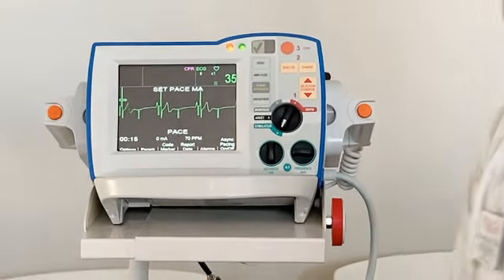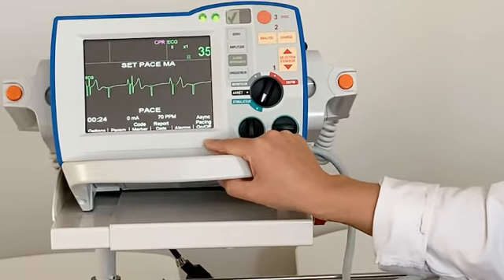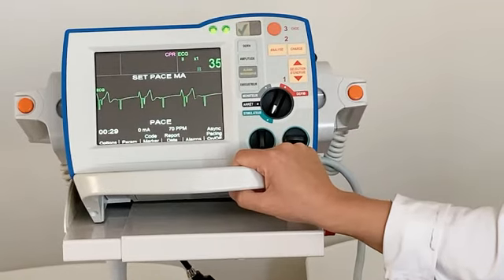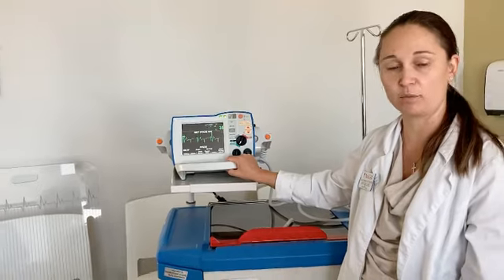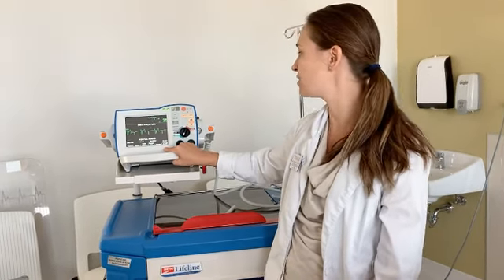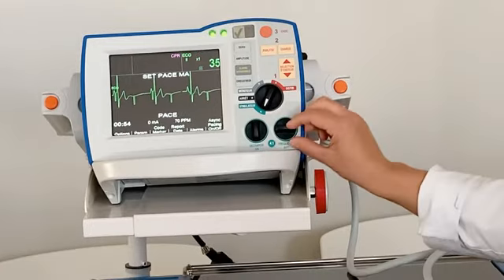I have two options now. I can pace synchronously or asynchronously. Best practice is to pace synchronously because, as you remember, in the patient's electrocardiogram there is a space that is especially vulnerable if we deliver a shock in that space. On a T wave, it's vulnerable to precipitating an abnormal heart rhythm that might be lethal, like, for example, ventricular fibrillation. So if I have the chance, I will pace synchronously, so I will make sure that's on. And what I'm going to do next is set the frequency.